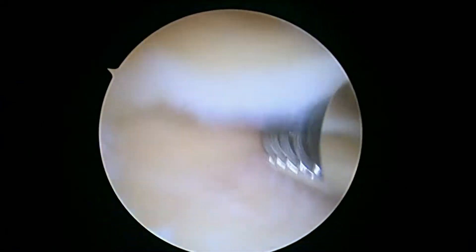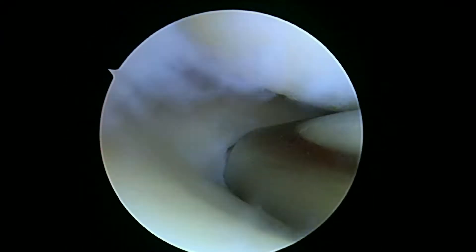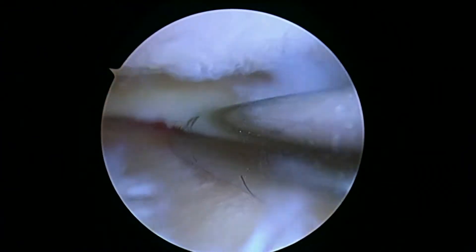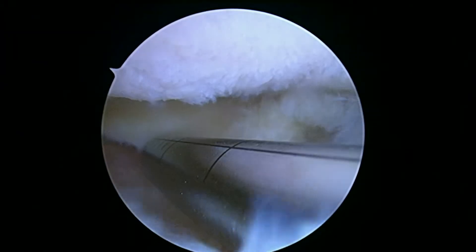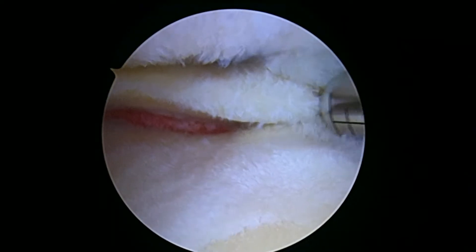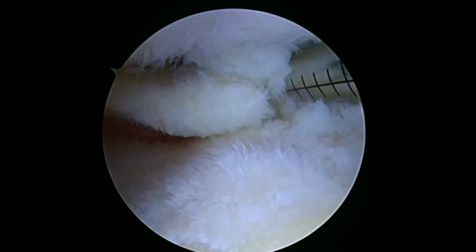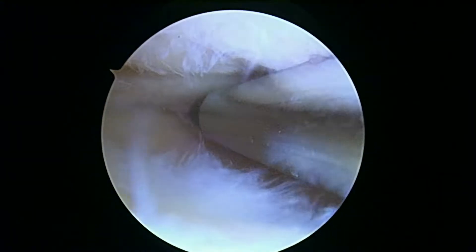Okay, now we're looking in the lateral compartment. You can see there's some tearing on the meniscal inner edge here. And again, we're using our shaver as a preliminary step to see how much we have to resect. And this is where we've got some significant tearing in the posterior horn that may be an issue we're going to have to deal with in just a second here.